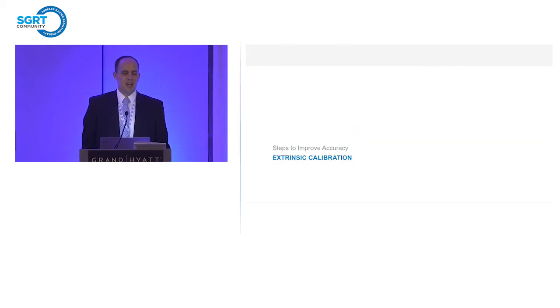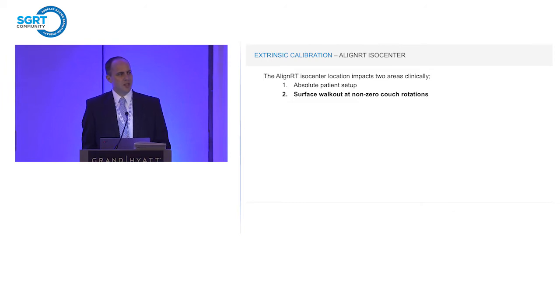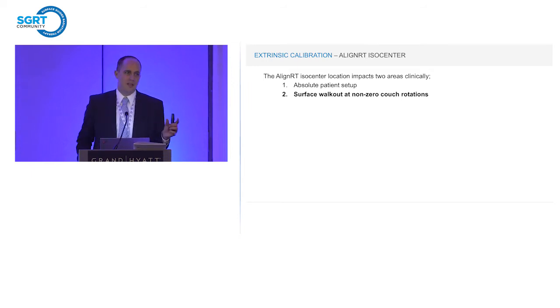So starting with extrinsic. So this is how well we define our isocenter for Align RT. So the first question is, how does this impact us? Why are we really interested in improving accuracy for the isocenter location? And there's really two key areas I think that are important here. Whenever we set up a patient against their DICOM surface, if there's an offset between the Align RT isocenter and the treatment isocenter, it doesn't matter how well you align the patient initially, they'll always be offset by that same amount that your isocenter's offset.